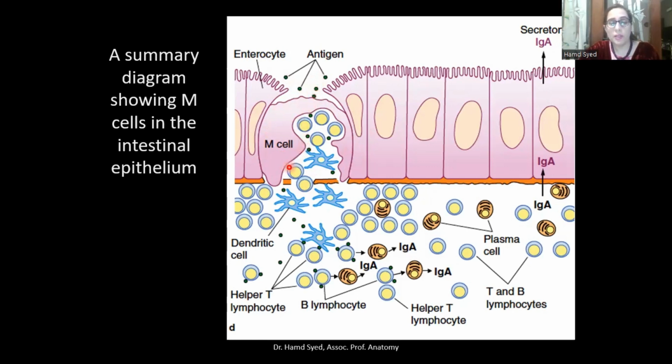And here within its basal portion, you can see the invaginations or recesses, which contain lymphocytes and antigen-presenting cells. So as the antigen is now taken up by this cell, it triggers a response from these lymphocytes. You can see the basement membrane over here is interrupted or porous.